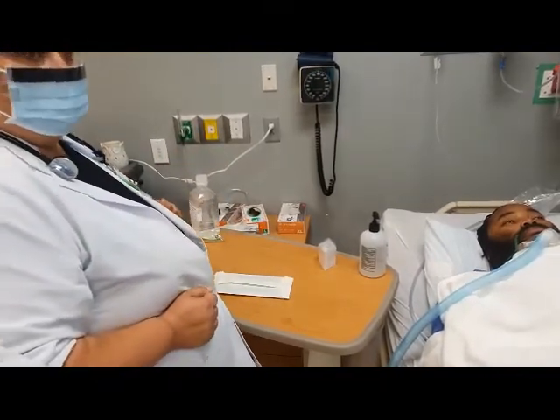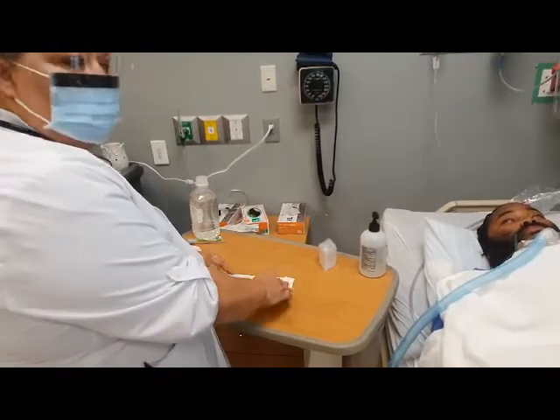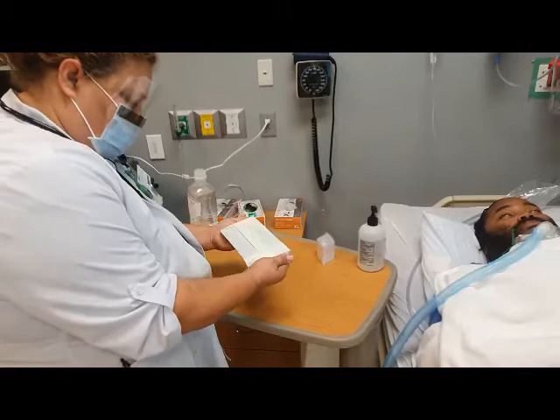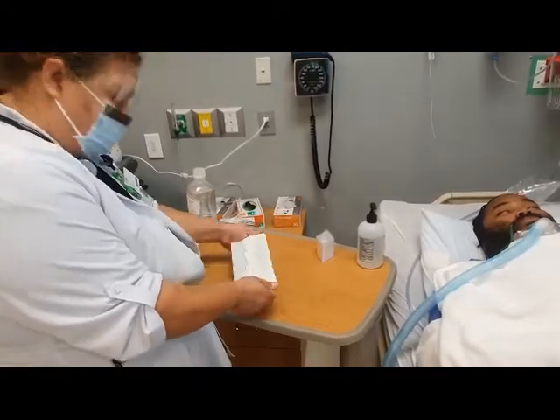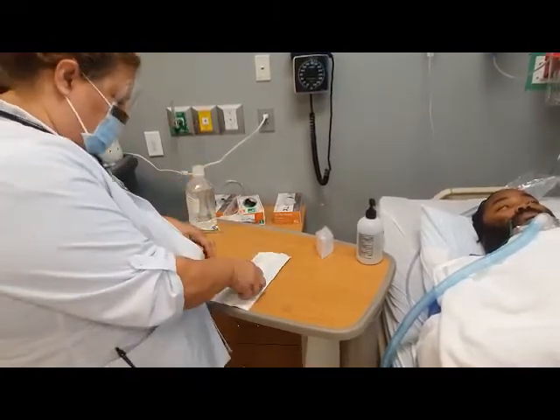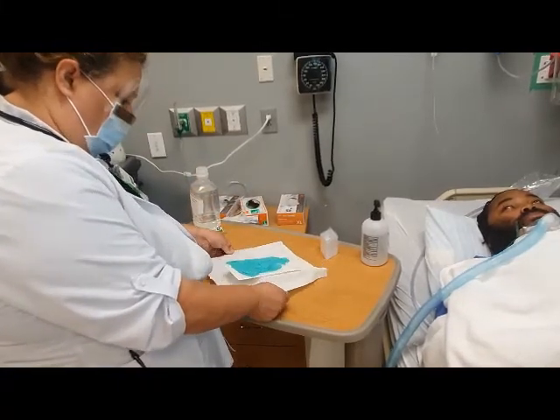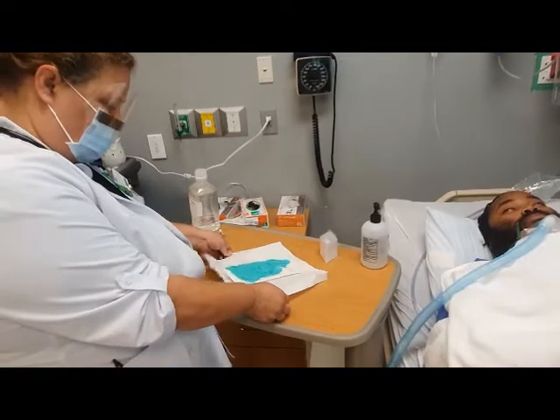Now you'll go ahead and don your sterile gloves. Just make sure when you're doing this to open them up and bend back every single individual fold so it won't flip back on you. See how I'm pulling right here? That way it won't open up again.